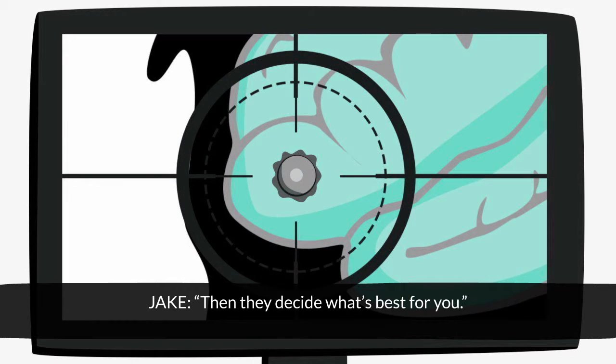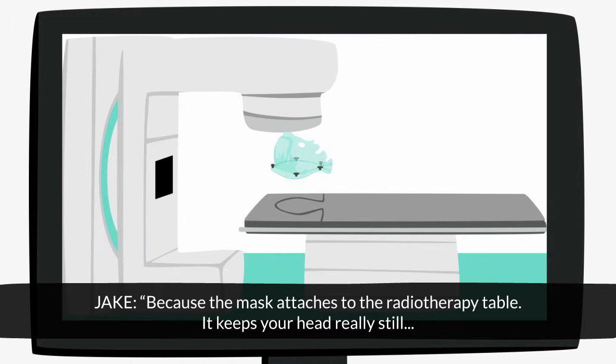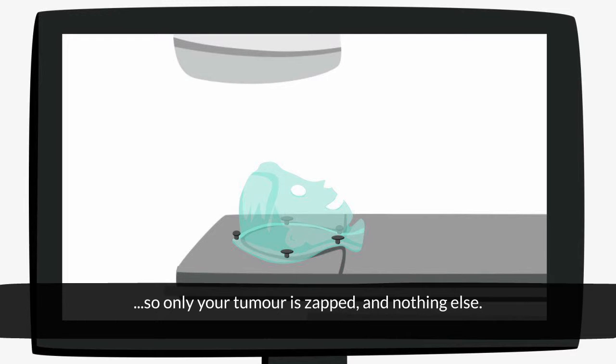Then they decide what's best for you. To have radiotherapy, you'll need a mask made too. Why? Because the mask attaches to the radiotherapy table. It keeps your head really still, so only your tumour is zapped and nothing else.